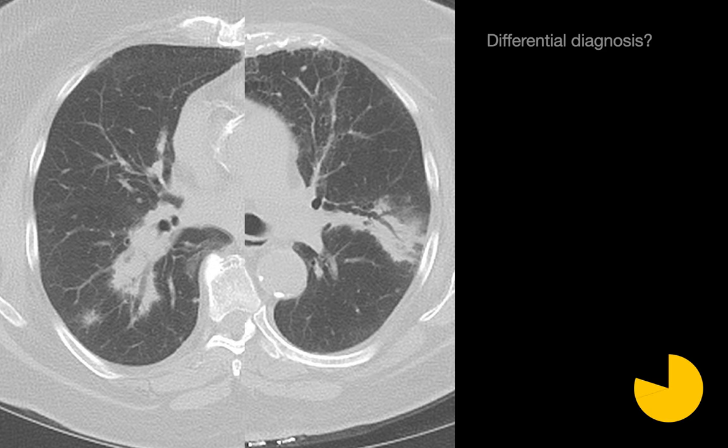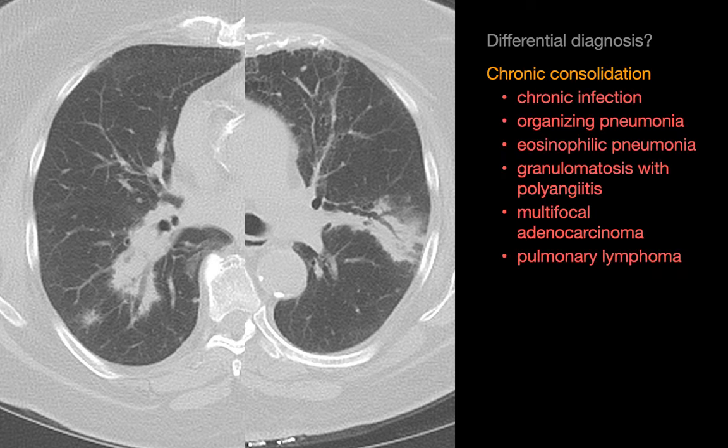What is your differential diagnosis for this case? The imaging finding is a region of peribronchovascular consolidation through which air bronchograms course. There is a subtle amount of local retraction and architectural distortion — a beaded appearance of the air bronchograms — suggesting a chronic rather than acute time course. The differential diagnosis for chronic consolidation includes chronic lung infection, organizing pneumonia, and GPA as the most common items.